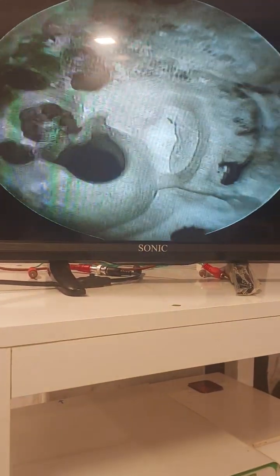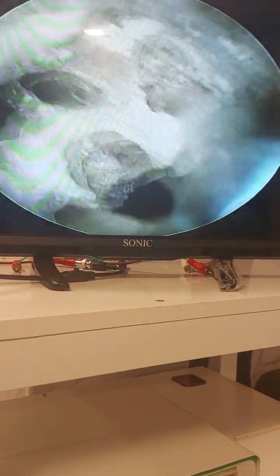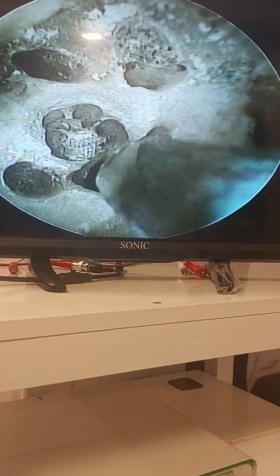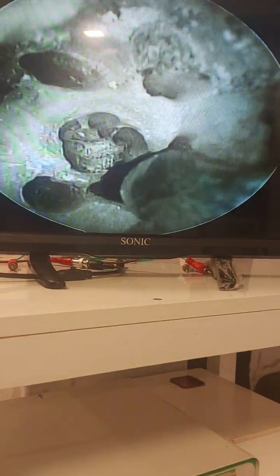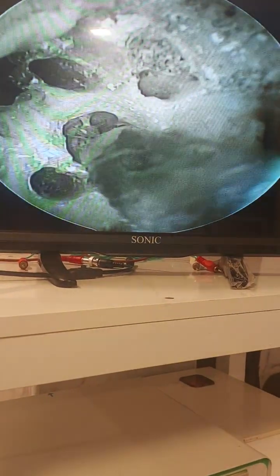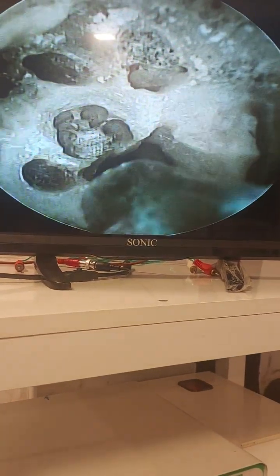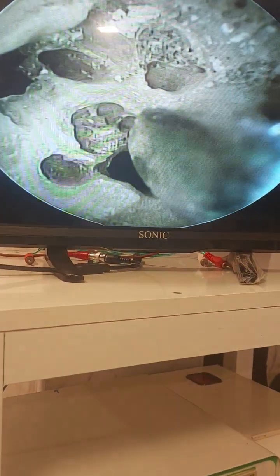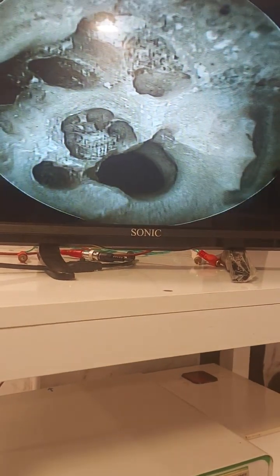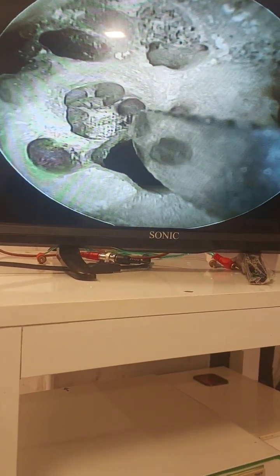In the beginning, we will focus on the cochlea. Can you see, this is the cochlea? This is the 3 turns of the cochlea, or 2.5 turns: the basal turn, the middle turn and the apical turn. This is the modiolus of the cochlea. Can you see the modiolus? The turns of the cochlea turn around the modiolus.